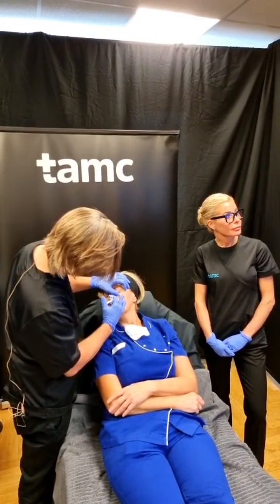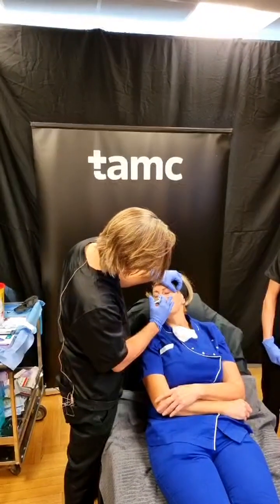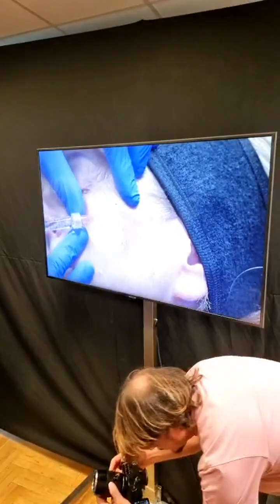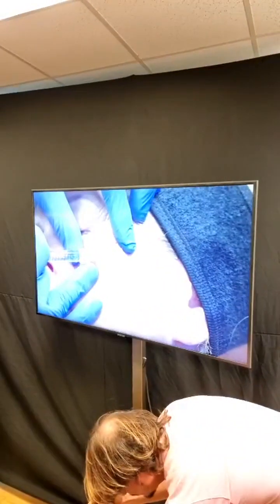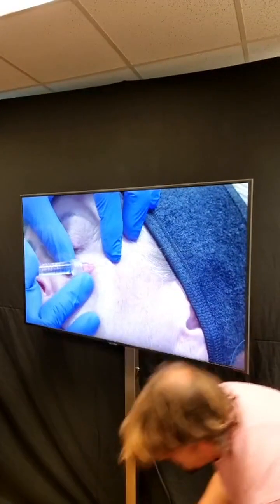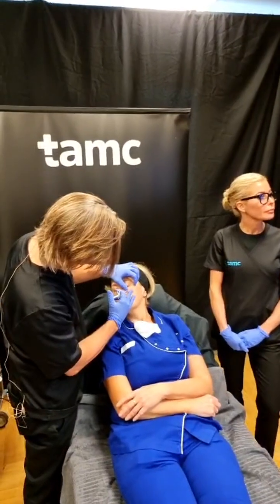This is what I call the Palma technique, which resembles the fern pattern technique except that it's just one-sided. You see that the strength here is making this second line more apparent. So the Palma technique is a combination of half a fern and a stem underneath, which is the volume needed to complete the non-surgical rejuvenation of the infraorbital area.